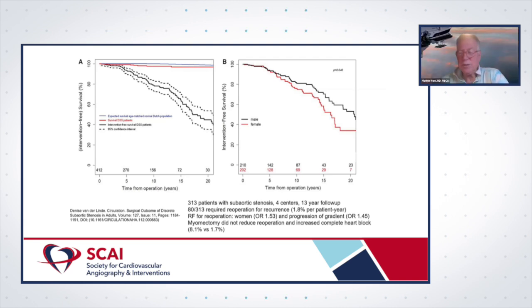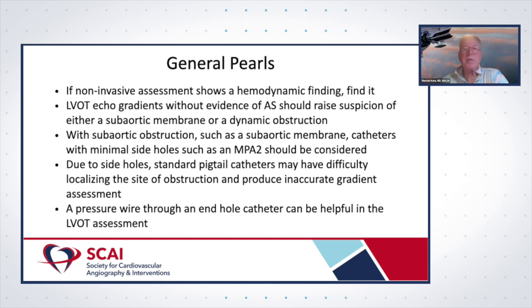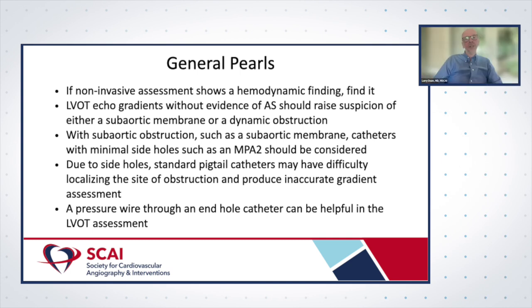And I think the diagnosis here really saved the day for this patient. So Larry, I'm going to let you wrap up with your hemodynamic pearls and general thoughts. Sure, thanks. So I think, again, the first bullet point here, we talked about this already, but if a non-invasive assessment shows a hemodynamic finding, find it.